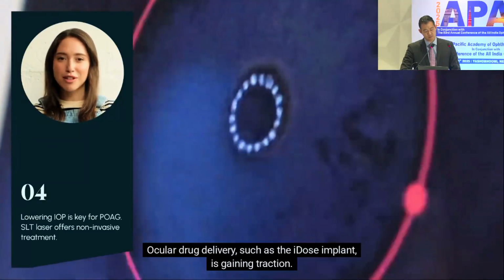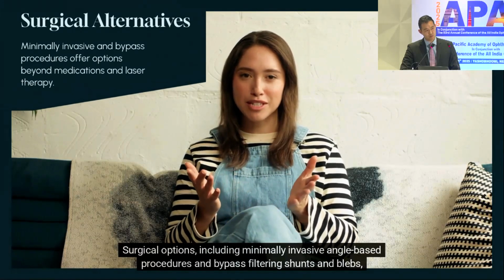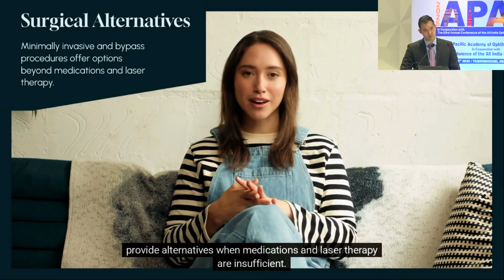Ocular drug delivery, such as the iDose implant, is gaining traction. Surgical options, including minimally invasive angle-based procedures and bypass filtering shunts and blebs, provide alternatives when medications and laser therapy are insufficient.